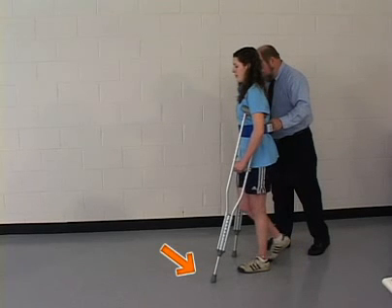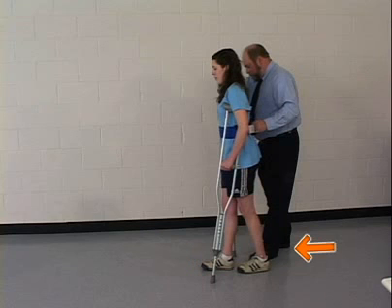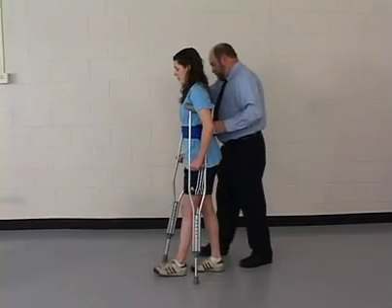Then she moves her left crutch beyond the right one. The patient advances her right lower extremity to a point even with the tip of her left crutch, while the therapist advances his left or inside foot. The patient shifts her weight to her left crutch and right lower extremity. This pattern is repeated.